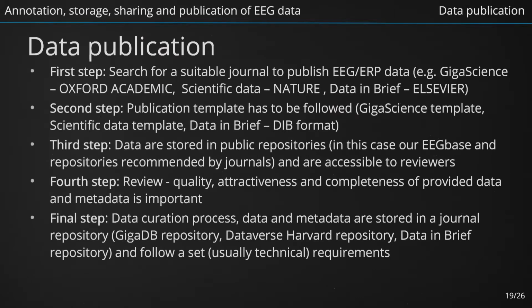Now we describe and generalize our experience with publishing raw EEG or health-related data in international journals, more specifically in GigaScience, Data in Brief, and Scientific Data. Our research objectives were various, for example, to make any conclusion about developmental coordination disorder in children from their EEG data, or to collect a large set of heterogeneous health-related data which could be used as a forewarning about various chronic diseases.